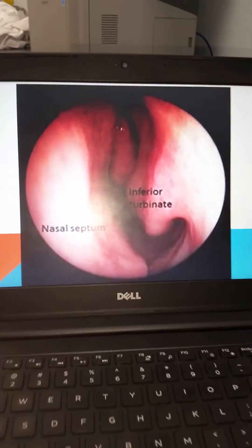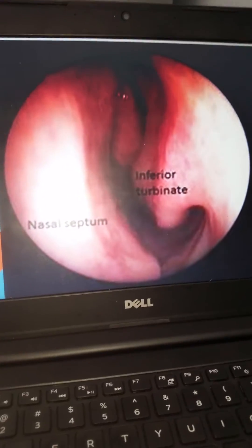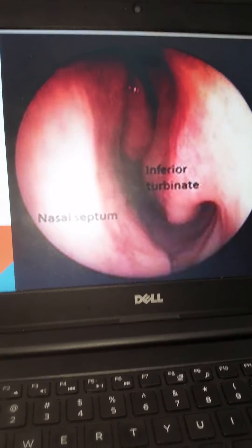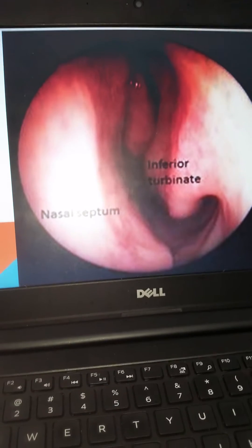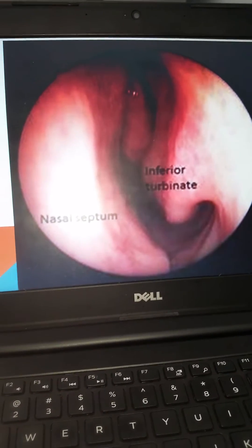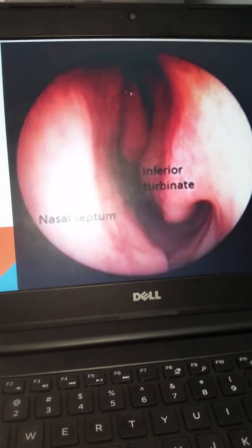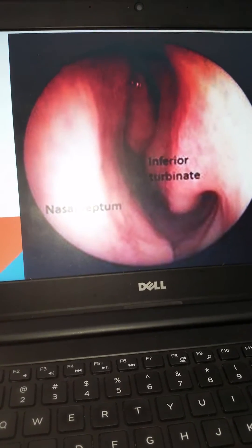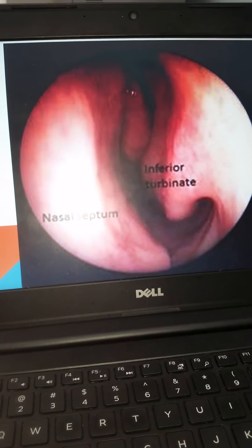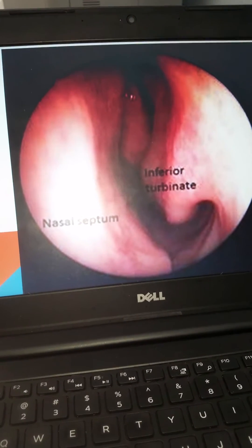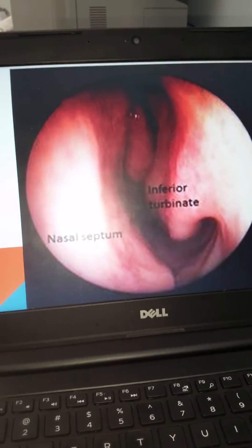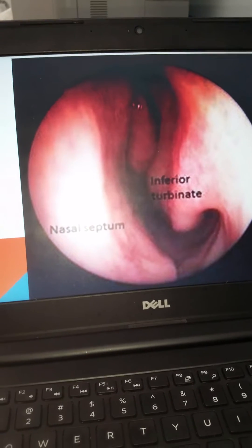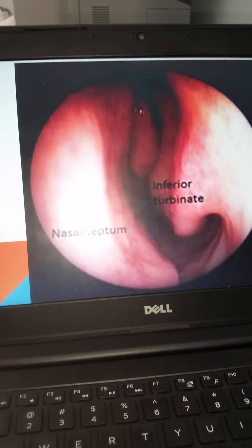You should see something like this when doing your nasal examination — the nasal septum and the inferior turbinates are visible. In some patients, you may also be able to locate the middle turbinate, which is the more posterior structure visible in the middle of the image.